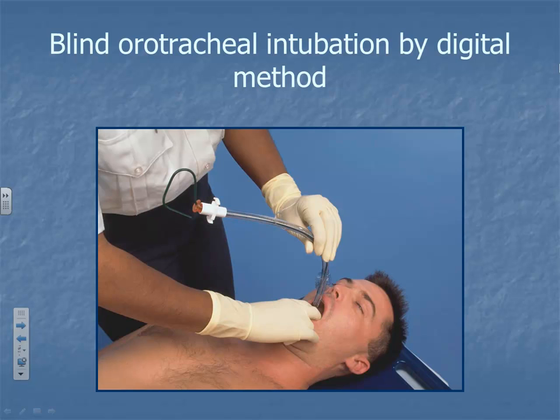I'm inserting this, and I can feel, of course it's not going to be inflated. Let me deflate that real quick. Okay. So I'm holding the epiglottis, and I've got my, is that your index finger? Is that your pointer finger? What do you call it? Anyway, you're putting this in. You're going to slide it just under. You're going to hook your pointer finger, and since I'm holding the epiglottis here, it's only got one place to go, right? Where? It's going to go through the glottic opening. That's right. So it's easy as pie. So you slide, you'll feel that balloon, and just slide it a little bit further, and then pull your hands out, blow it up, secure it, and check that you're in the right spot.